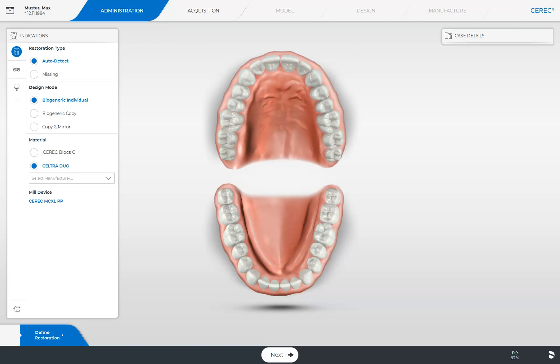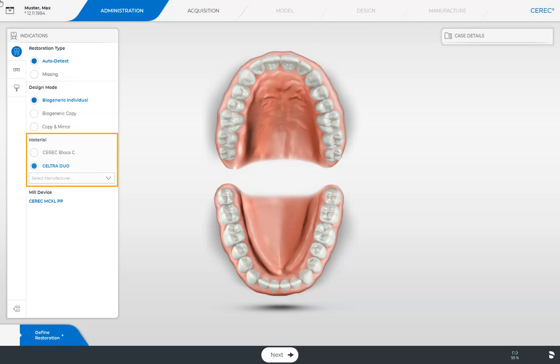Here we start with the single tooth restoration type, which is already selected. This includes the indications crown, inlay, and onlay, and in the case of anterior teeth, also veneer. Since the CEREC software automatically recognizes the indication after the scan, we continue with the definition of the design mode, the material, and the milling unit.